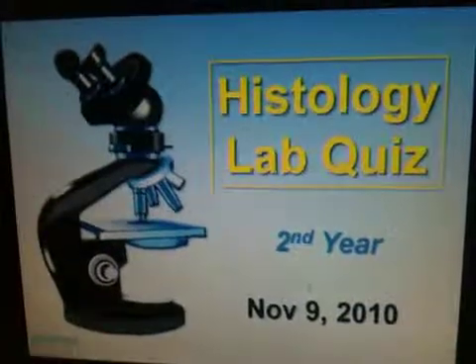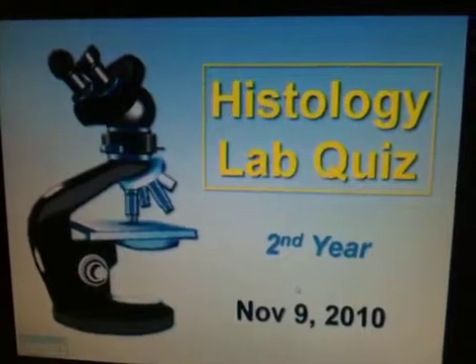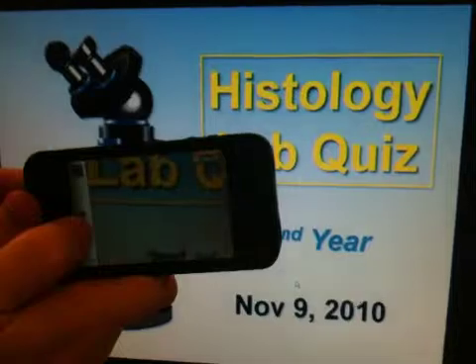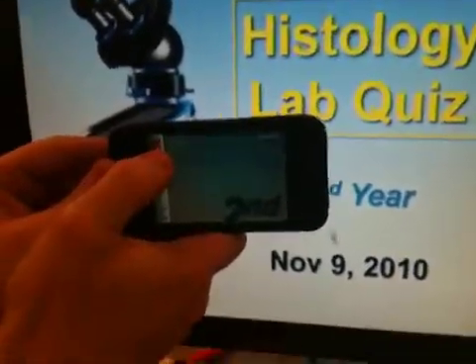Okay, we'll start the post-lab quiz. This is for you, Jerusha. It's all content from this semester. You'll see some familiar ones, I hope. I apologize, Jerusha. So let's begin. Travis, get out of there.